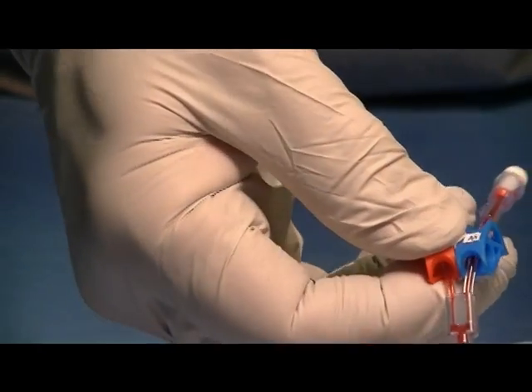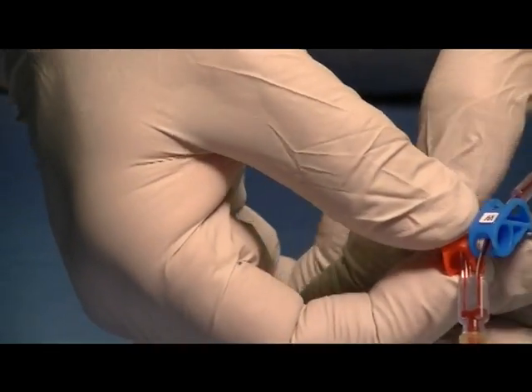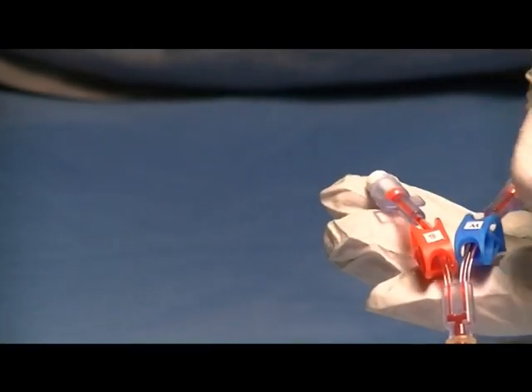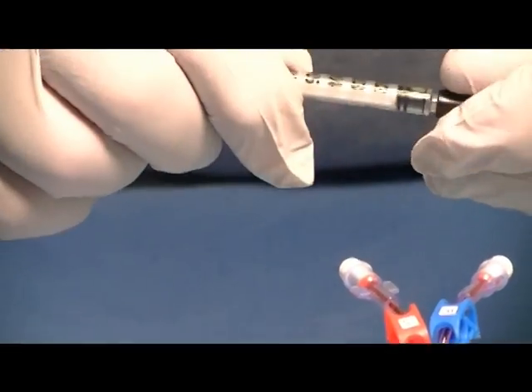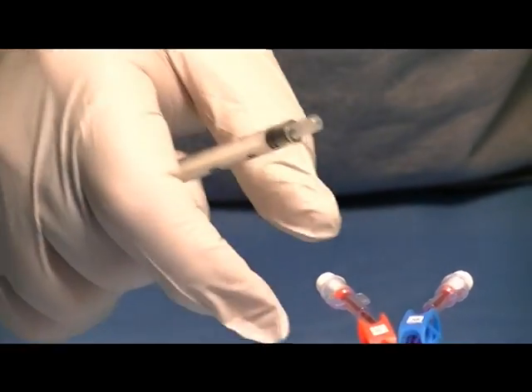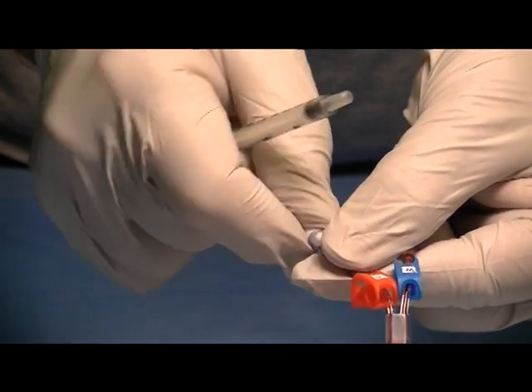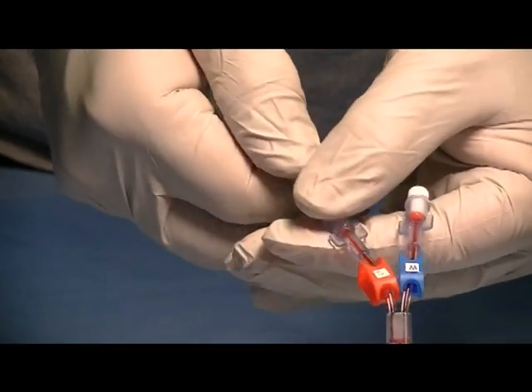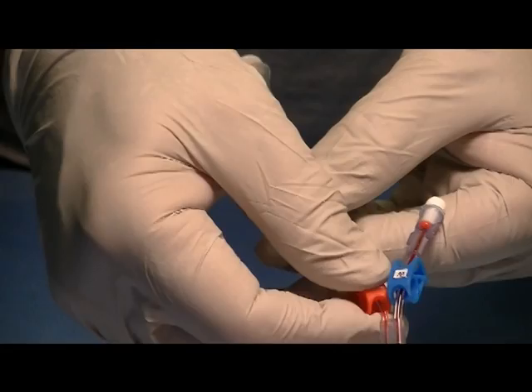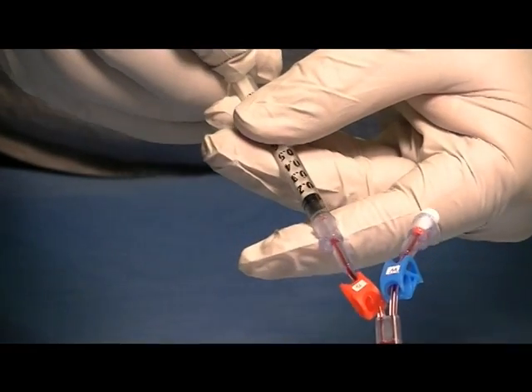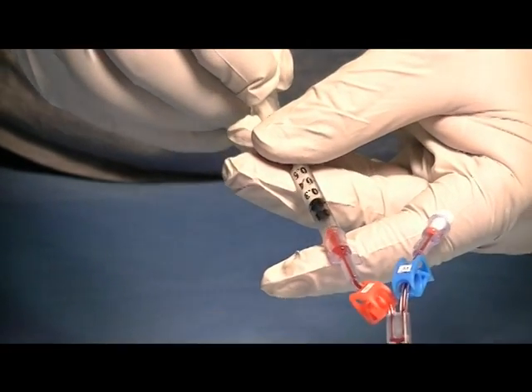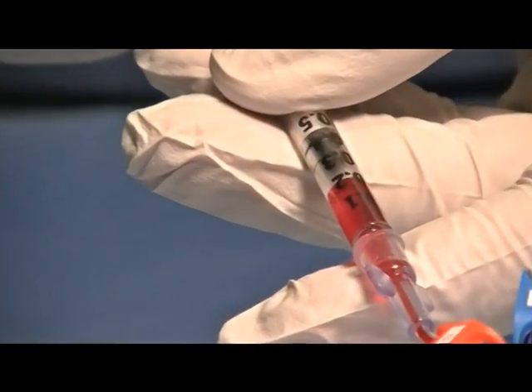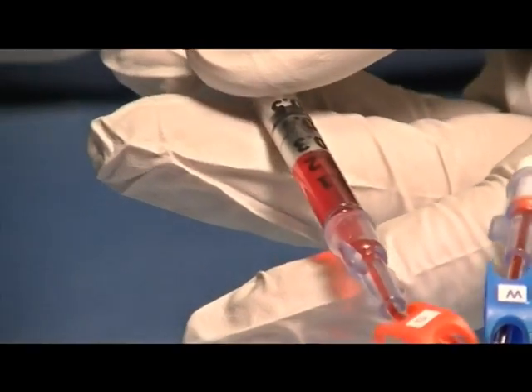At that point, you would reclamp the red clamp and get the blood gas syringe, remove the white vent plug and attach the blood gas syringe. Unclamp the red clamp and draw back the appropriate volume of blood sample that you need, .2 for example for a blood gas.